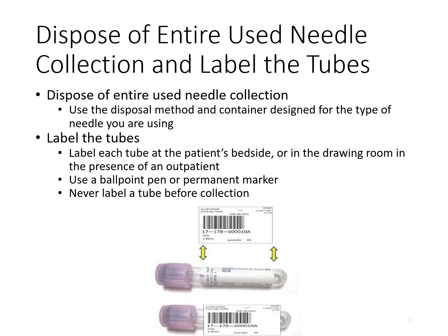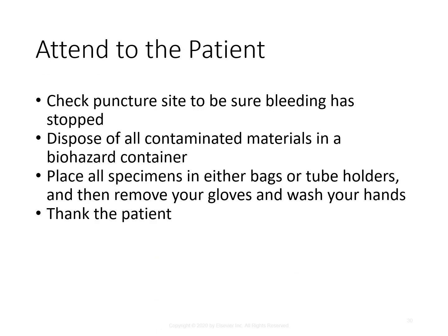The label must have the patient's name and ID number, the date and time of collection, and your initials or ID number. If you are using computer-generated labels, make sure that the label has all the required information and then add your initials or ID number and date and time of collection.